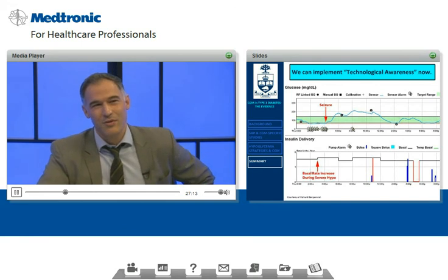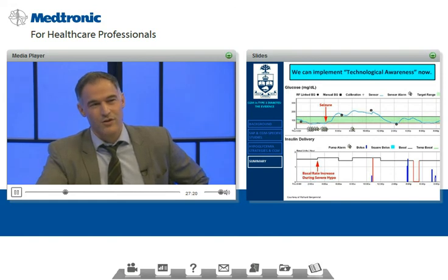But maybe I'll return to my key message, which is now it looks like we can implement technological awareness. Remember in my introduction, this is a slide that I've borrowed from Rich Bergenstal, where on the top panel you see that someone had hours and hours of hypoglycemia before they had a seizure. It's an unfortunate case. And you can see that their insulin delivery is programmed so that during that time they were hypoglycemic, there was a pre-programmed rise in the basal rate.